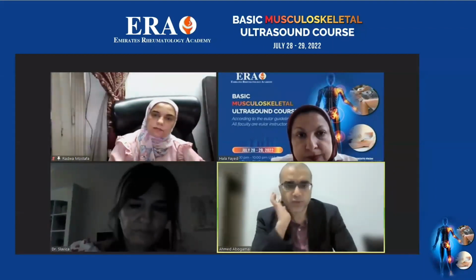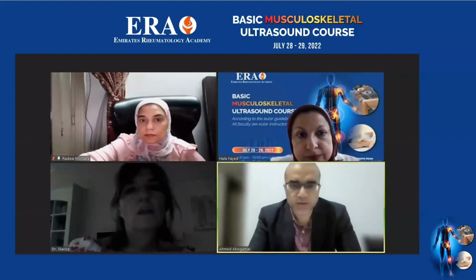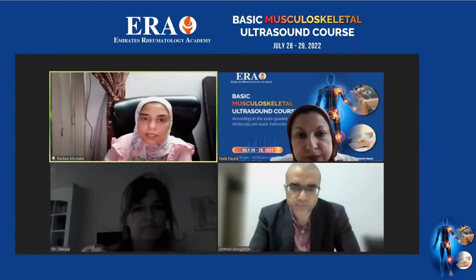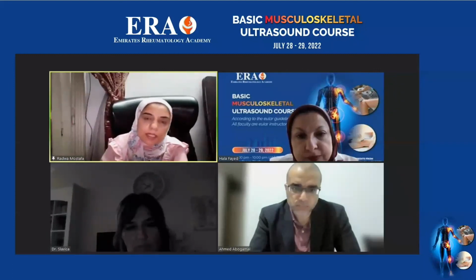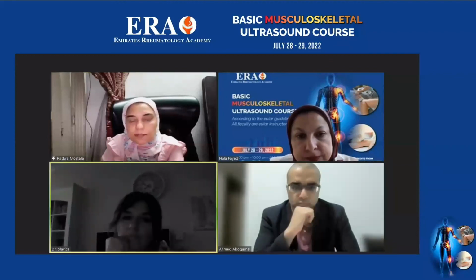Okay. Rado, what would you prefer for ultrasound guided injection of the plantar fascia? What's your approach? Always using in-line scanning with the transverse. I turn my assessment of the lesion in long axis, turning my probe to the transverse, and then be in line with the needle and see the injectate above the sides of the plantar fascia. This is the most preferred. I don't prefer out of plane.